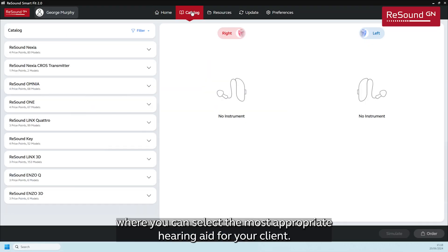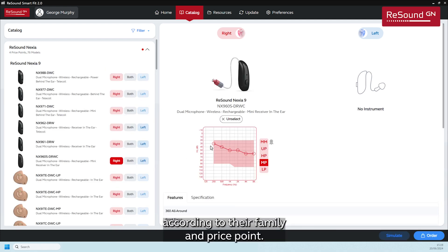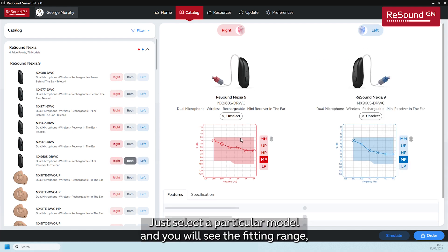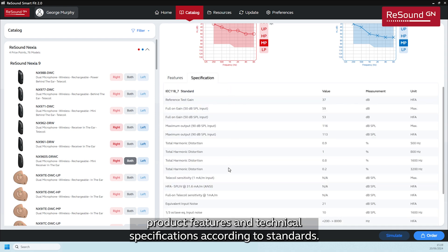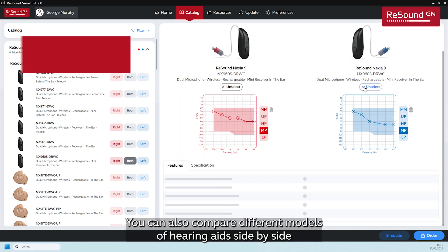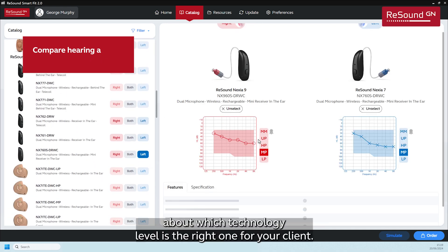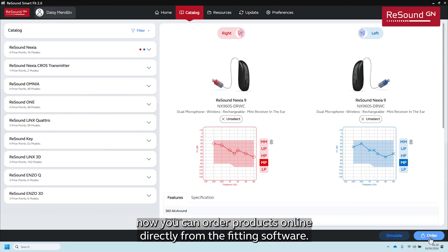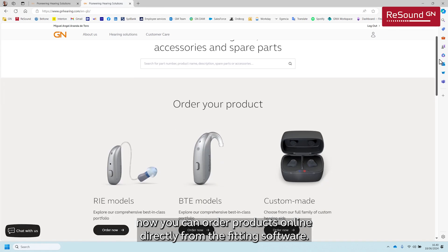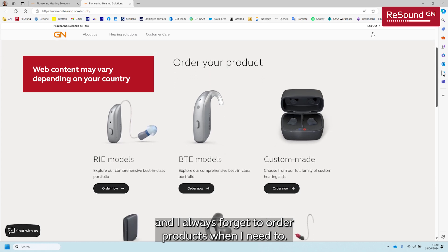The first one is the catalog page where you can select the most appropriate hearing aid for your client. Here you will find all our hearing aid models according to their family and price point. Just select a particular model and you will see the fitting range, product features, and technical specifications according to standards. You can also compare different models side by side in case you are in doubt about which technology level is right for your client. And here at the bottom, you can now order products online directly from the fitting software — I love this new feature!